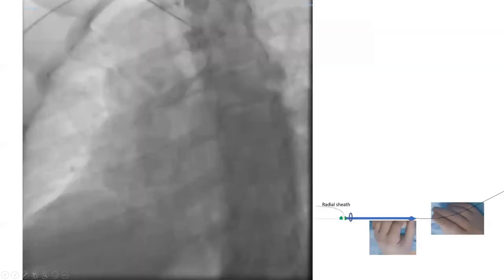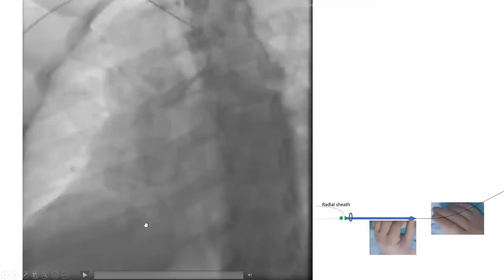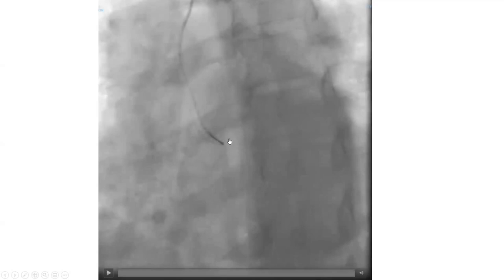We tried to eventually get down to the valve. We were able to jump onto the left cusp. My immediate reaction here — considering how difficult it was — is to think of engaging from below. That should be your immediate reaction. If you do any wrong maneuvering trying to engage directly from above, your catheter flies out, you lose everything and have to start over. So it's important to try to engage from below, which is what we did here.